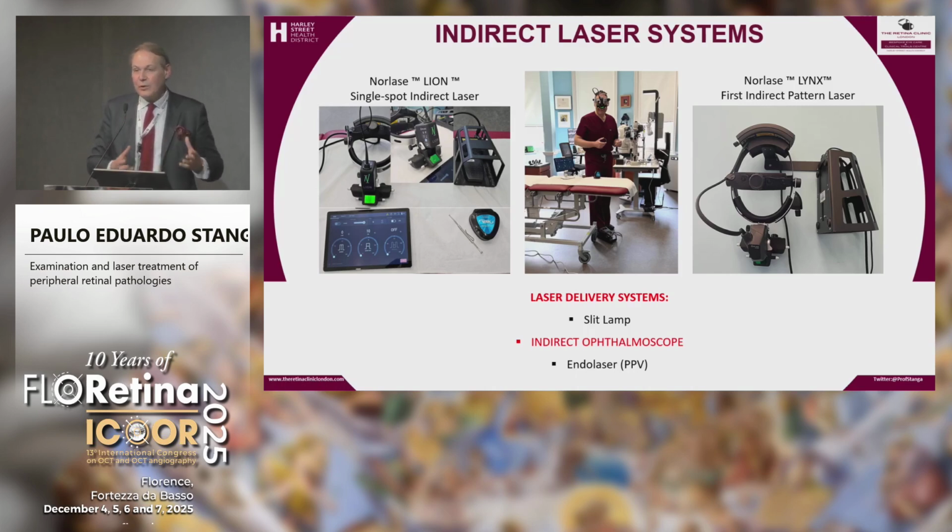It's a self-contained laser, but the beauty of it is that all the laser source is within the headset. So you've got the headset, a pedal, and this tablet, and you can also talk to the tablet. The tablet can increase or decrease the power and duration with voice command. And nowadays, I've moved to the Lynx, which is a pattern indirect ophthalmoscope.